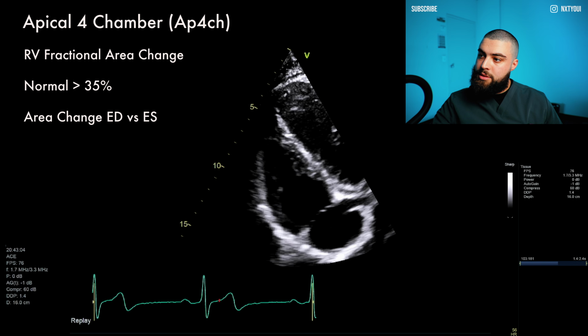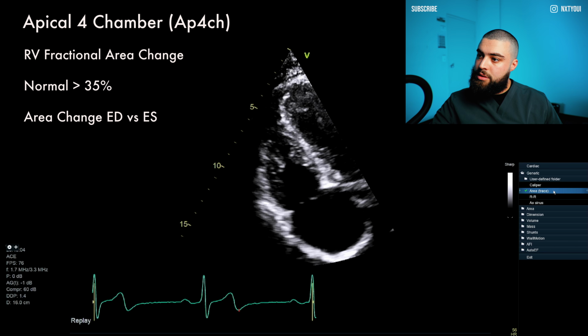And scroll forward to, yeah, measuring all the way up. Coming around. I'm trying to exclude those trabeculations as well. You can store that as well.